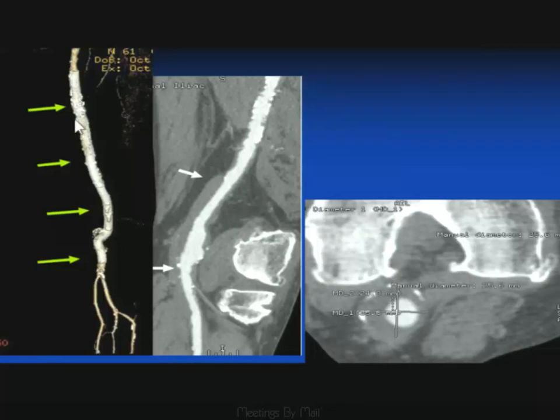So this is showing you this patient with a long segment stent in the popliteal artery. Looks as though what is being demonstrated here is that the stent may have ended around about this level, and below the level of the stent, we have a persistent, partly thrombosed popliteal artery aneurysm that's being measured on the axial plane, giving its true dimensions, both AP and lateral.